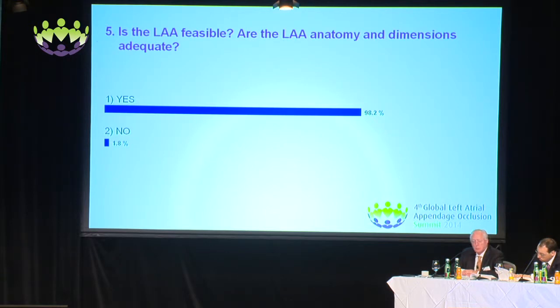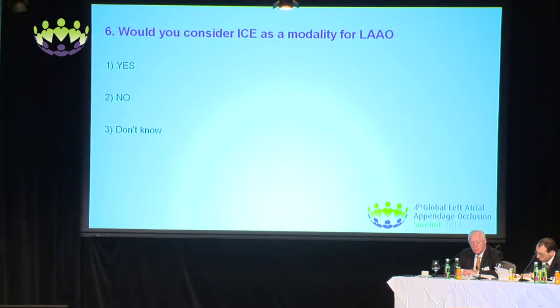The second question. Would you consider the ICE as a good modality to guide the LAA occlusion procedure? Yes, no, don't know.